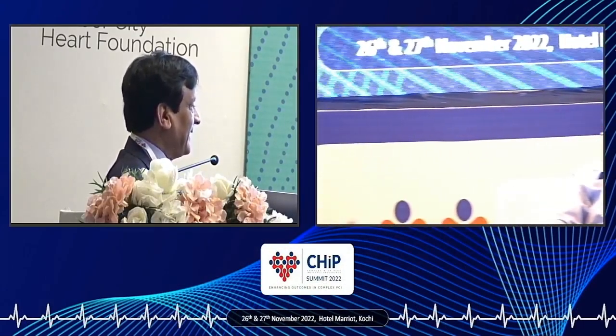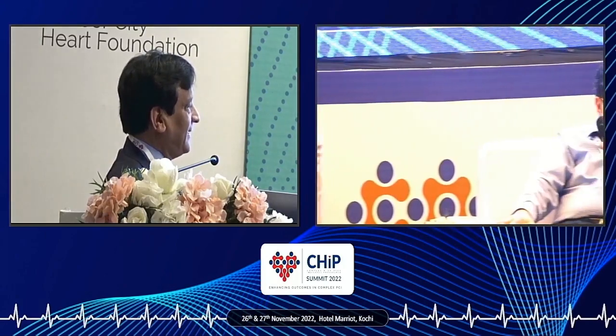Yeah, the forward-looking shockwave is also coming, where you have a forward shockwave instead of lateral shockwaves. That usually is just to help deliver your IVL balloons. Last comment from Dr. Trev: putting a temporary pacemaker for LAD rotablation.